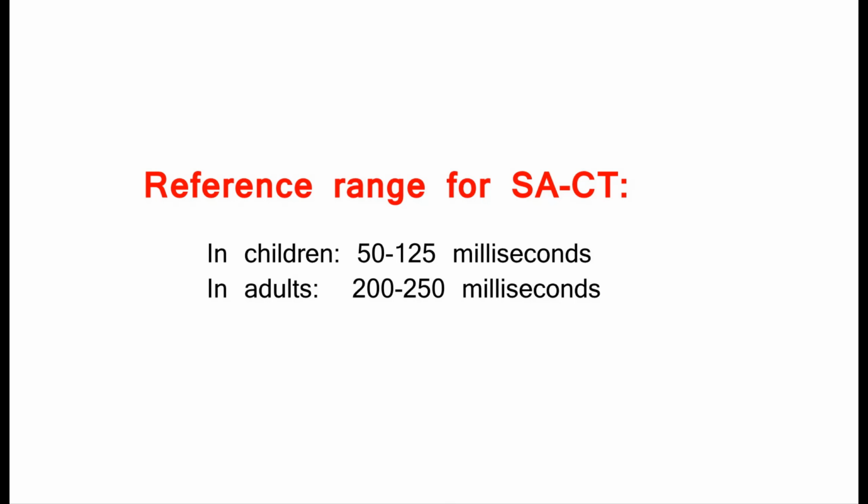Reference range for SACT. In children, 50 to 125 milliseconds. In adults, 200 to 250 milliseconds.